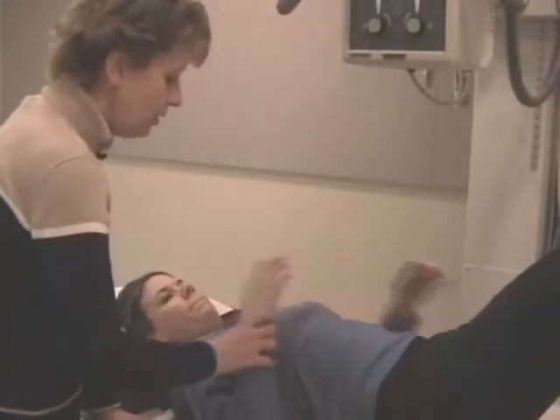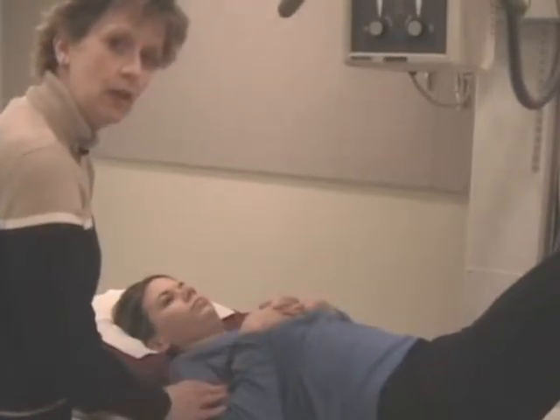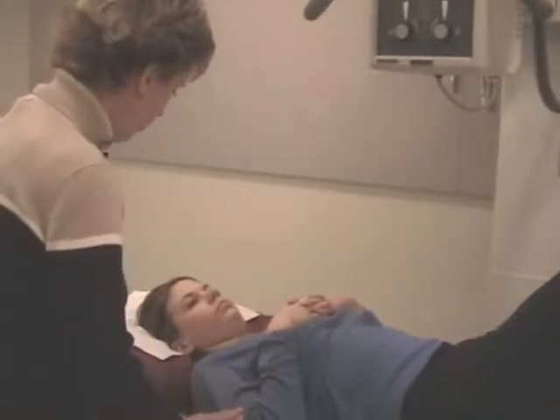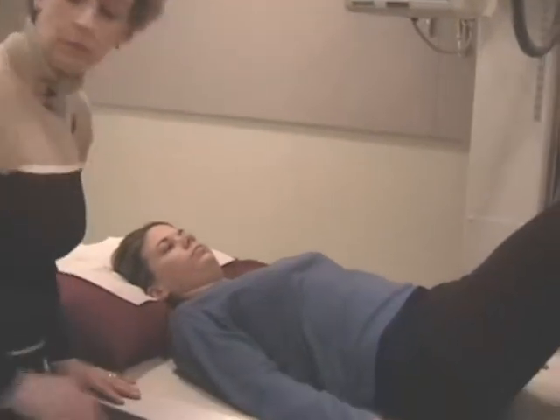If you have them up, just make sure they stay out of the light source, stay out of the collimated field. So I'm going to ask my patient, where would you like your hands? Are they more comfortable on your chest or down to your side? Okay, so she's going to put them down.